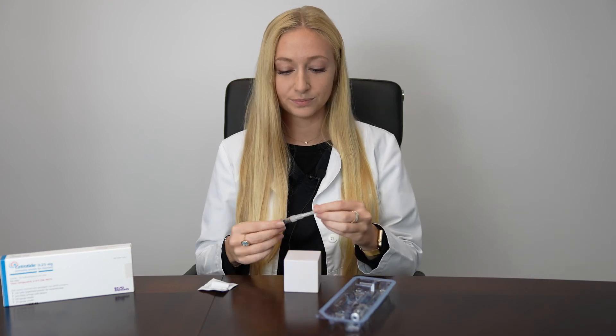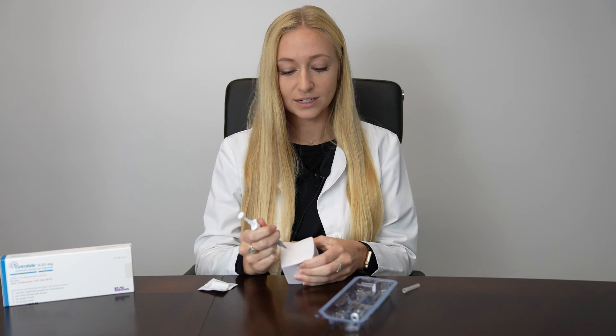This will be a subcutaneous injection in the abdomen. Wipe the skin with alcohol, pinch and squeeze, inject at a 45 to 90 degree angle, and inject the entire contents of the syringe.